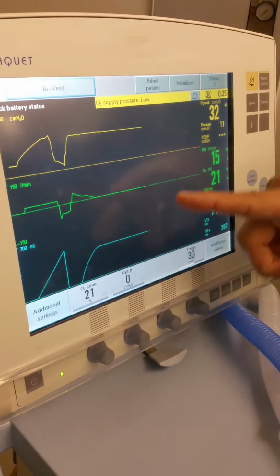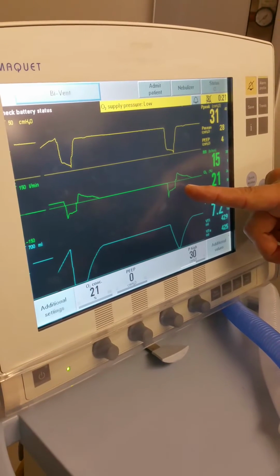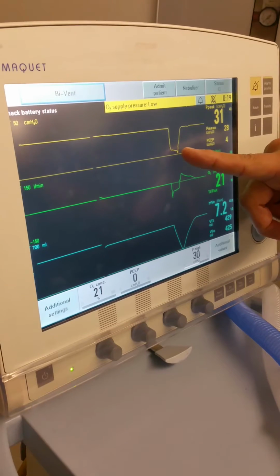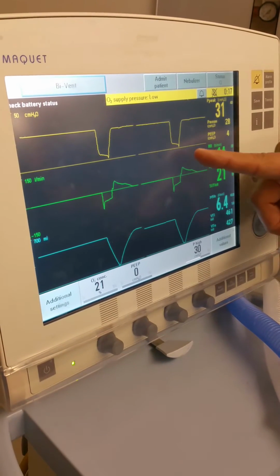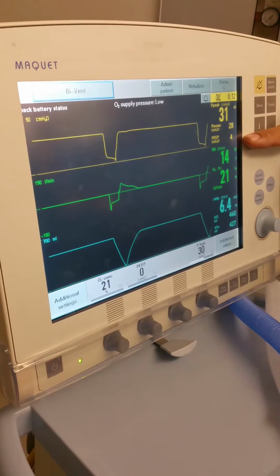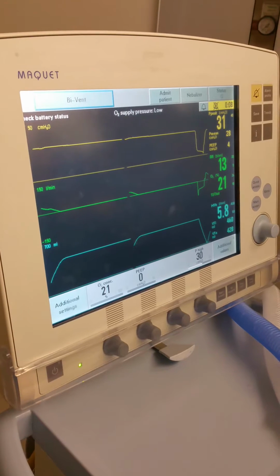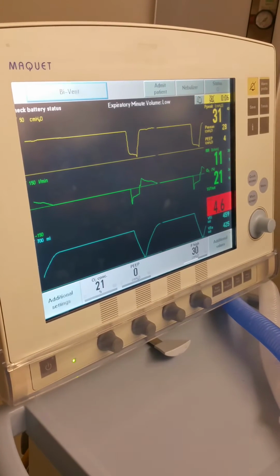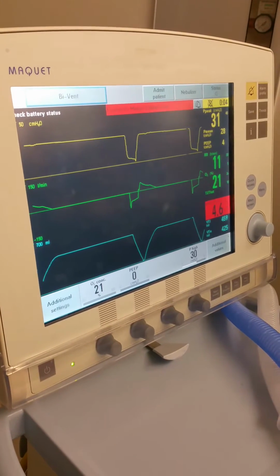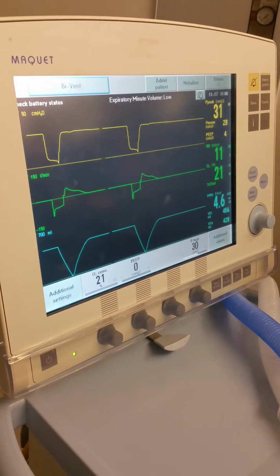So you can see if I set a PEEP right now, because I'm doing a release, I'm actually not even going to get down to 0 pressure. My residual PEEP is still maintaining at about 4. Because our release time is so short that we don't let the baseline alveoli collapse. So we have some residual PEEP that's left in the alveoli. Okay. Go ahead.